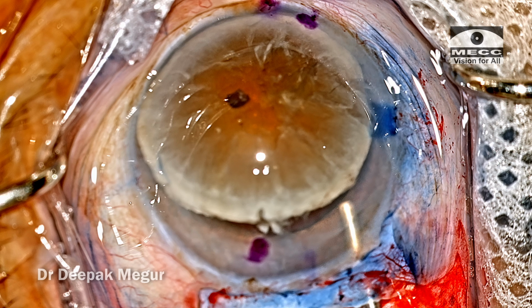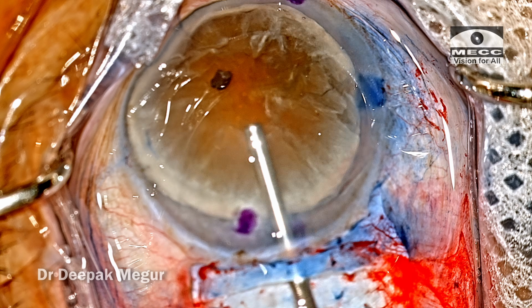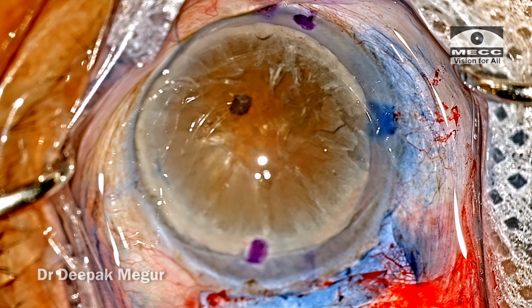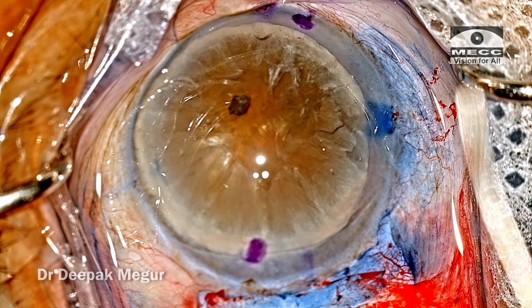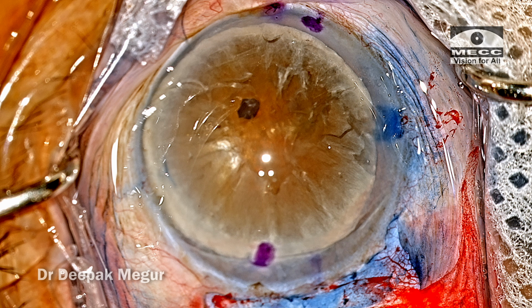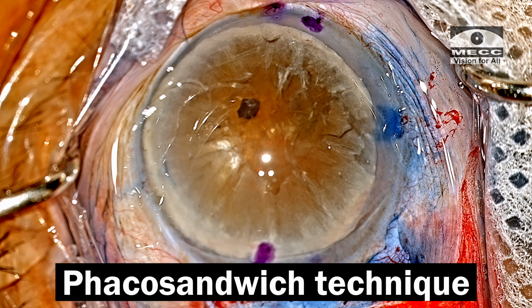I don't want to struggle anywhere while extracting the nucleus, simply because these old patients are very vulnerable to endothelial damage and Descemet's membrane detachment. So nucleus delivery has to be as gentle and as uneventful as possible. My preferred technique is the phaco sandwich technique.